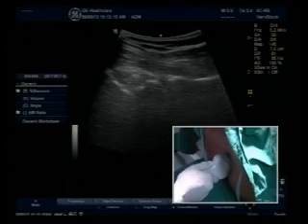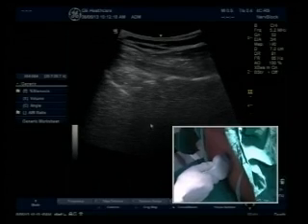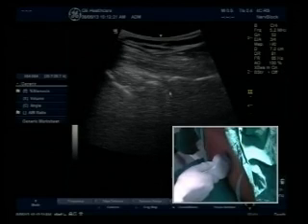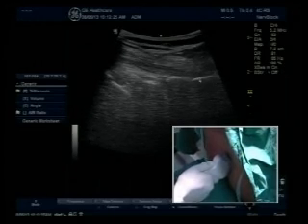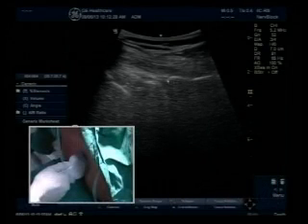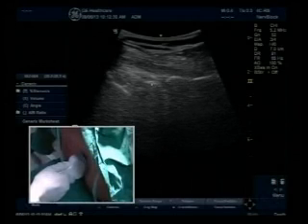So you see the sacrum. That's the first anatomical structure you see, and you want to see it because then you know where is L5, where is L4, where is L3. So there's a continuous structure. The right side is towards the sacrum. Right side, the pointer is at the sacrum. Yeah, because it will be seen as a continuous line now.